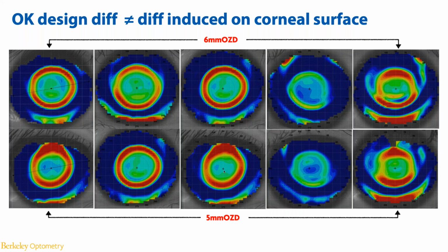I've had 4 patients so far that I have successfully troubleshot. They have pretty ideal centration and great ocular surface health, but just a tiny bit of undercorrection due to a slight undercorrection of the corneal center.